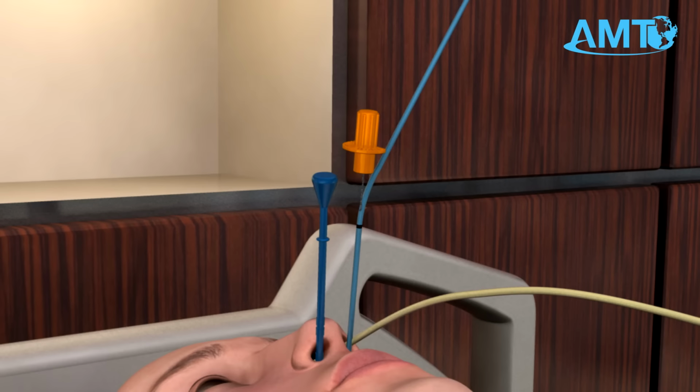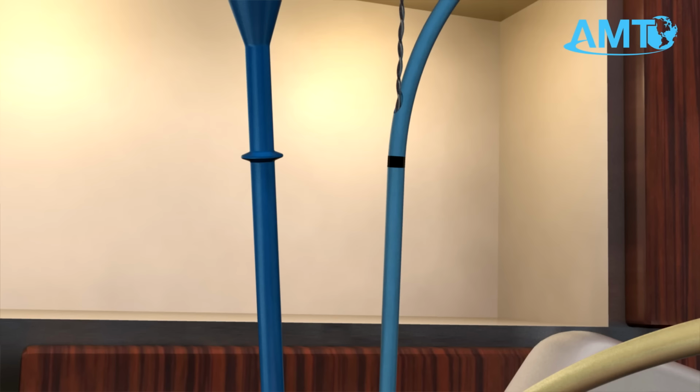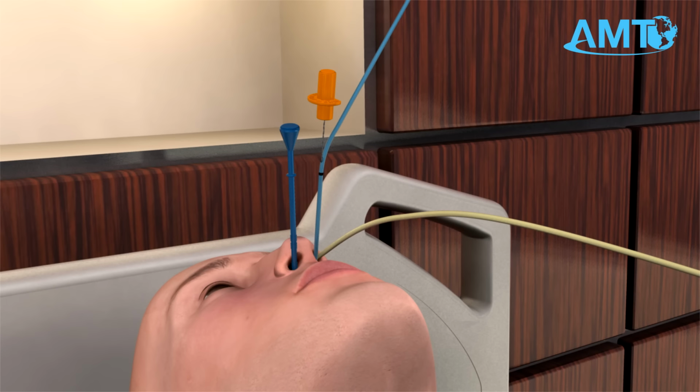If you're having trouble getting the magnets to connect, it may be beneficial to have the depth indicator markings line up together. If issues with connection continue, gently twist the probe side to side and up and down to encourage the connection. If with the aforementioned method no contact has occurred, advance both the flexible bridle catheter and the probe. Once contact has been achieved, remove the orange stylet completely from the bridle catheter.